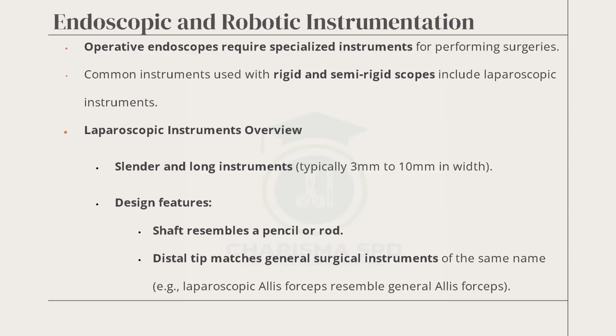Okay. Then we have some other laparoscopic ones. We have the tenaculum. It's sharp. It's meant to punch out some holes where they need it. All right. They are all determined by the surgeon. You don't have control over what you should put in there. You go according to what you see. Next one.